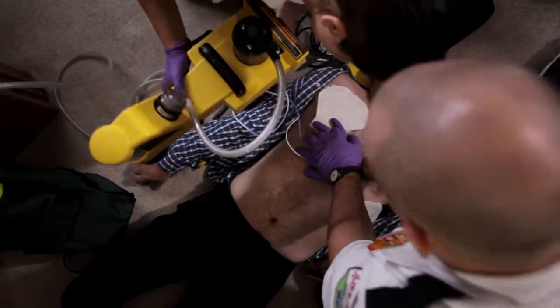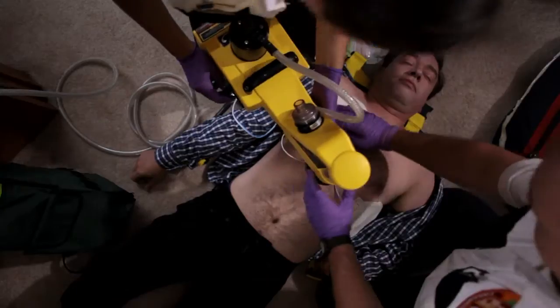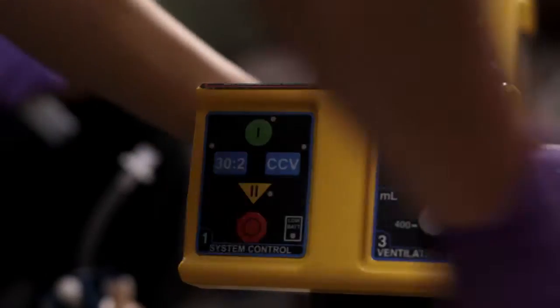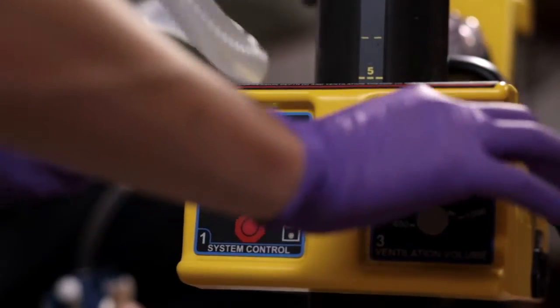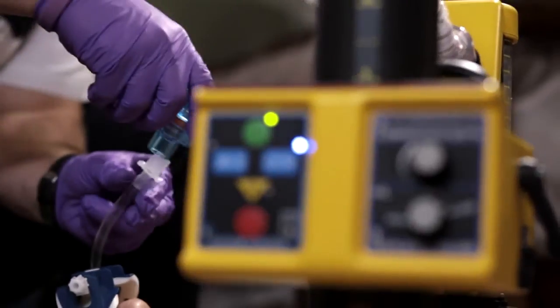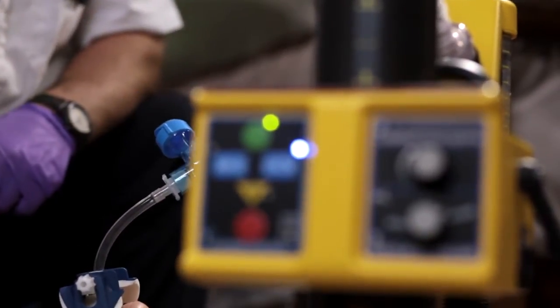Once the unit is securely inserted into the backboard, the Lifestad arm swings in and the massager pad is placed directly on the patient's sternum. The unit is then locked down. Once the paramedic presses the start button, the mode of operation, compression depth, and ventilation volume are dialed in. The ventilation hose connects to the paramedic's existing patient airway.